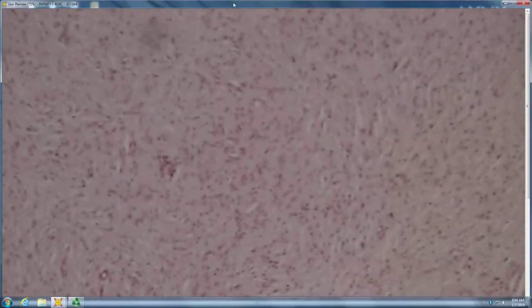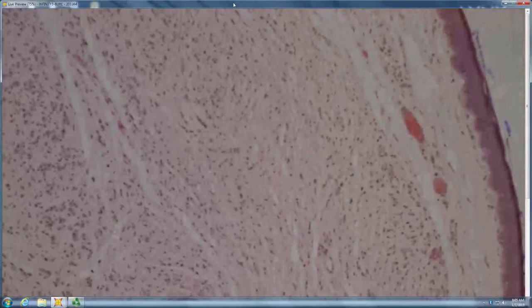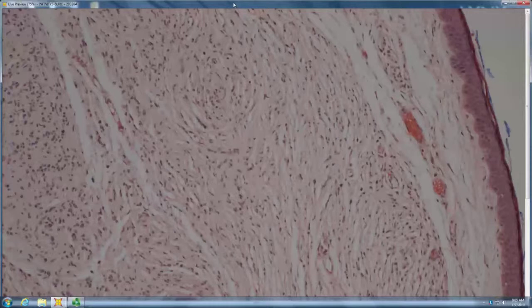So what might you want to look for? I will do an EMA. Yeah, so this could be a neurofibroma that's just a little plywood-like. They're called thumbprint neurofibromas. Or it could be a sclerosing perineurioma.